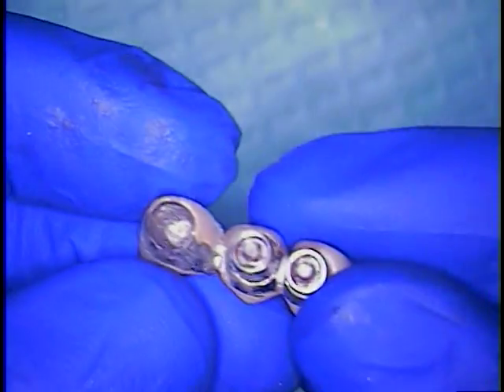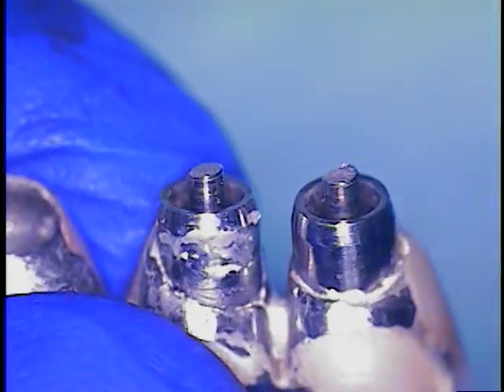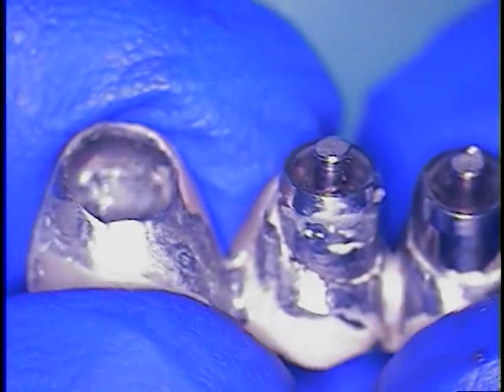This is Dr. Jerry Cuomo. I want to just do a final epilogue to this case. This case came in with a fractured bridge, and of course these are solid abutments found off the shelf, but prepped in the mouth directly, so they are stock abutments.